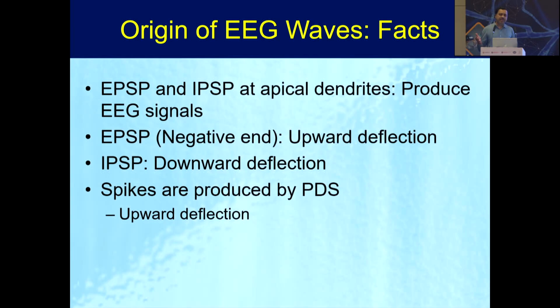In epilepsy, which is a state of hypersynchrony, there is a hypersynchronous discharge of a large group of neurons, and that is why the deflection produced will be large. That is how the spike is generated in epilepsy. This is known as the paroxysmal depolarization shift, because of the increased excitability as well as the increased hypersynchronization.